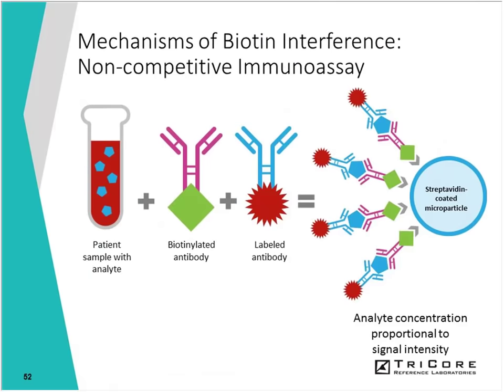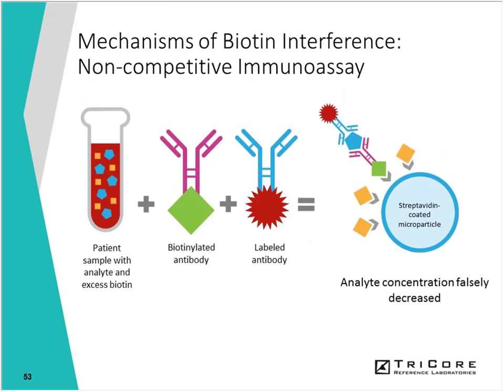So let's take a look at how biotin can interfere in immunoassays that utilize biotin in the reagent system. In a non-competitive immunoassay shown here, antigen in the patient sample is incubated with a biotinylated capture antibody and a different labeled antibody. These complexes are subsequently captured by a streptavidin-coated microparticle, and when the signal intensity is measured, it would be proportional to the analyte concentration, the antigen concentration.